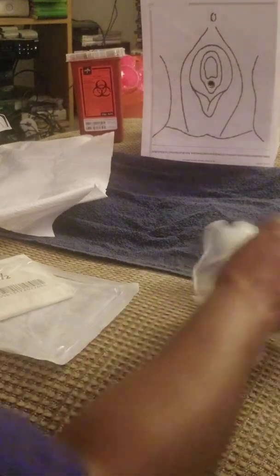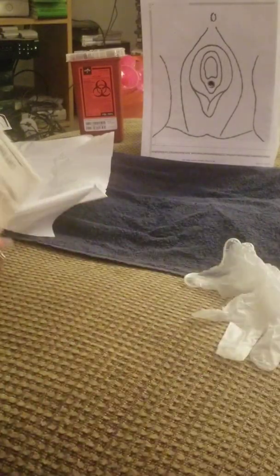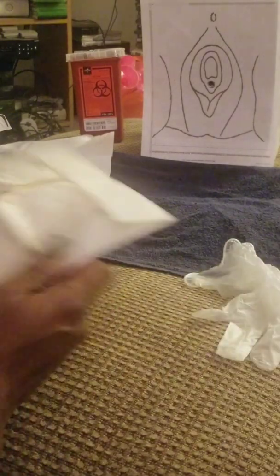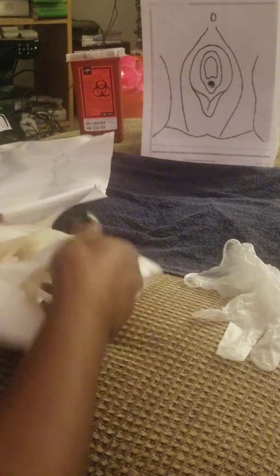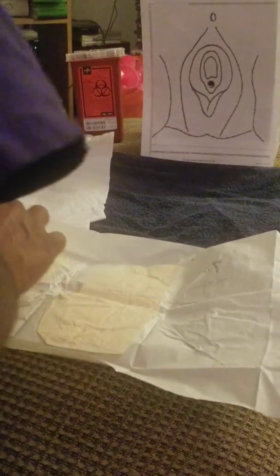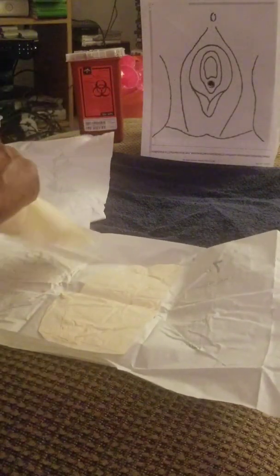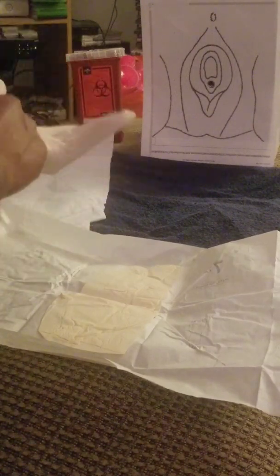So now I'm just backing things up a little bit, especially since I actually have a pair of sterile gloves in here that came with it. Obviously, my hands are washed. I do know how to open up sterile gloves. Again, I personally don't think that this is the right kit, but I'm going to work with it the best I can. I am going to don sterile gloves, obviously not touching any other sterile part.